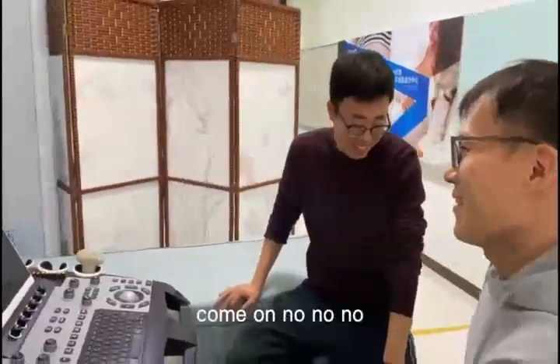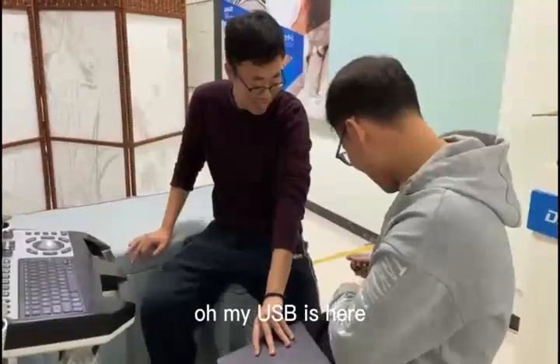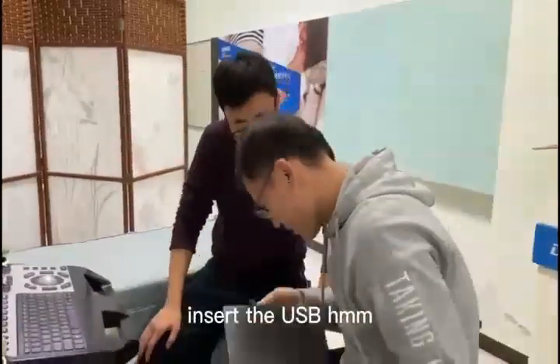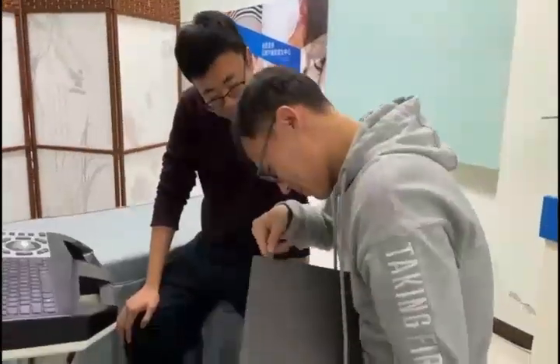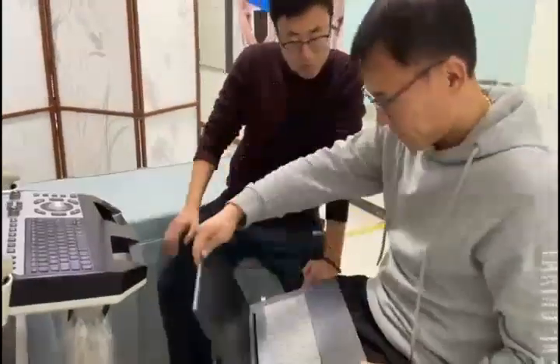So stupid. No, no, where is my USB? Oh, I got it. Oh my USB is here. Come on, you see? I can see. Insert the USB. Oh, I can see.